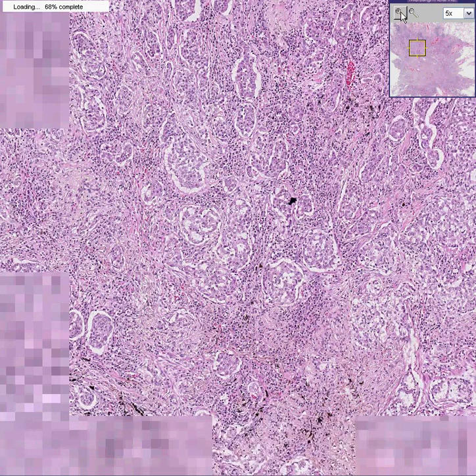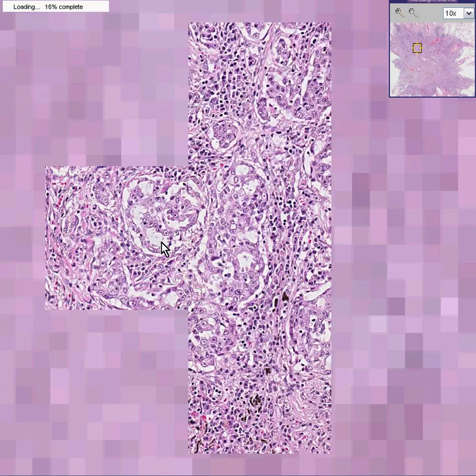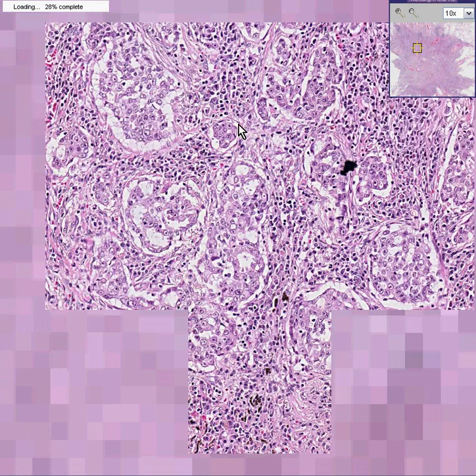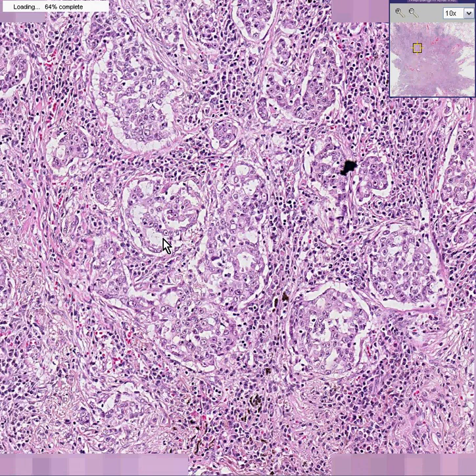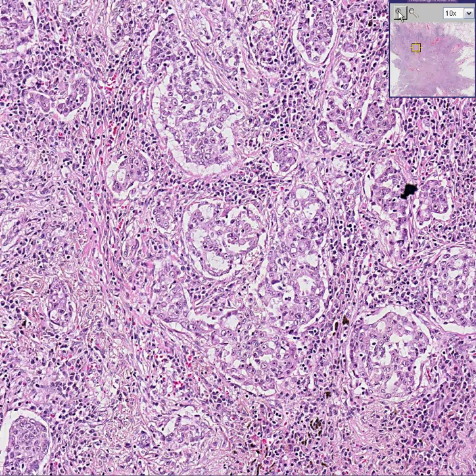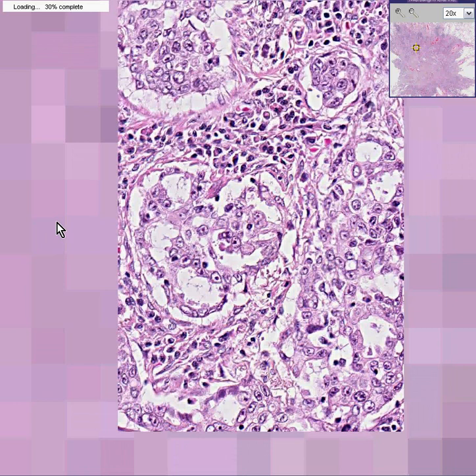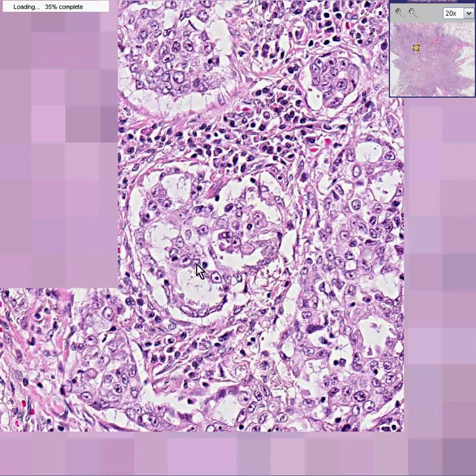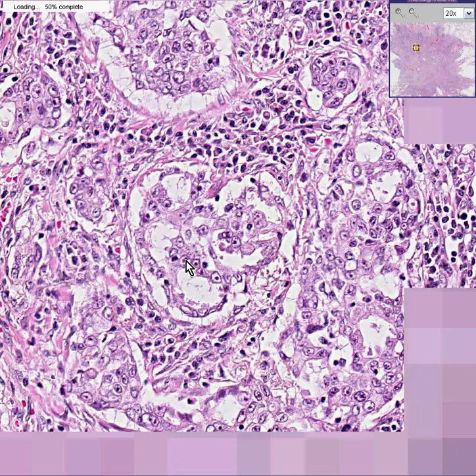You could appreciate that right away. You can appreciate the fact that some of the glands are very poorly formed. You could appreciate the fact that some of the glands look better in terms of having a central lumenal differentiation. You could appreciate the fact that around these infiltrating nests, there are a lot of inflammatory cell infiltrates. And even though you already know this is a malignant process from its irregular, haphazard growth pattern and its poor delineation into the surrounding lung structures, you could see also from a cytologic point of view that the cells comprising these glands are big, dark, lumpy, and irregular.